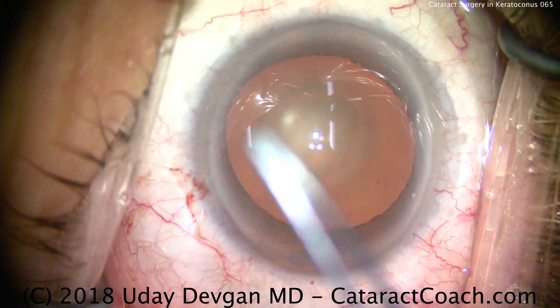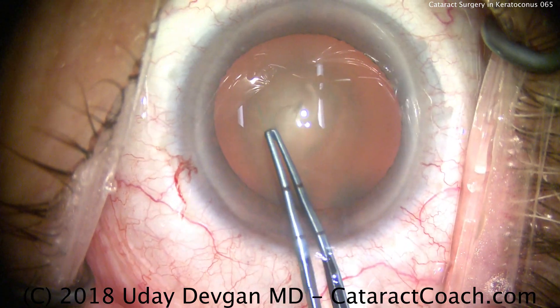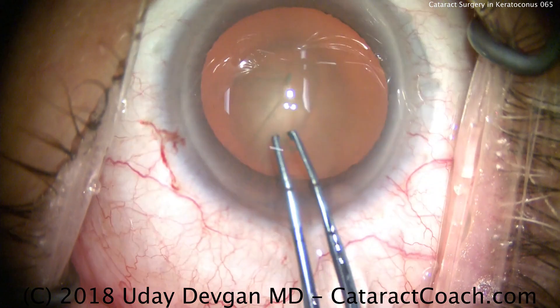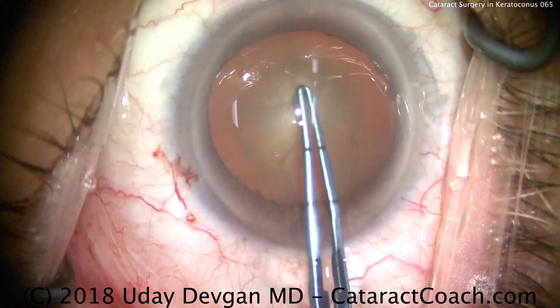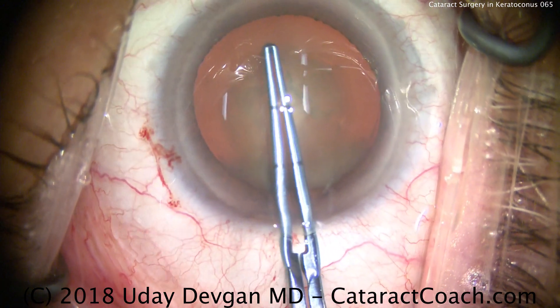Now we'll do our capsulorhexis. These may also be myopic eyes — larger eyes, larger white-to-white. Make sure, like we'll do here, to measure with the forceps to create a 5 or 5.5 mm capsulorhexis. The marks on my forceps are 2.5 and 5 mm from the tip, so I want to create just about a 5 mm capsulorhexis. That's very important in this case, because it's going to hold the lens securely in position.